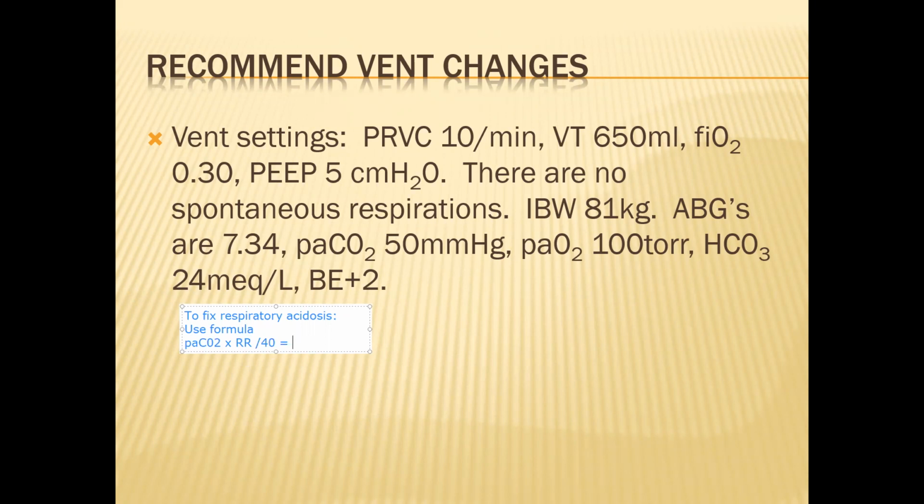So we're okay with that, right? Okay. So since we don't have to change the tidal volume, you're right, we don't need the minute volume in the formula. We can just do respiratory rate and get a quick answer to what the respiratory rate should be changed to. And so it was 50 times 10 over 40.